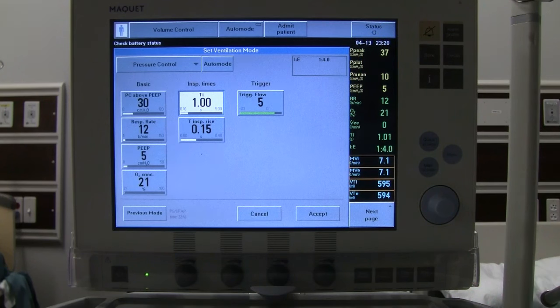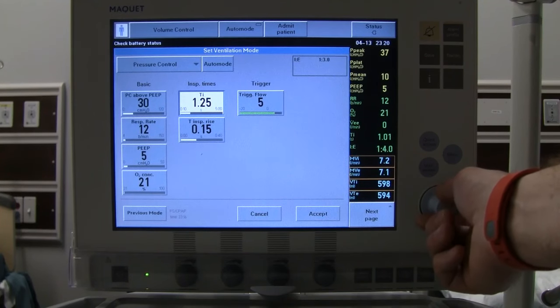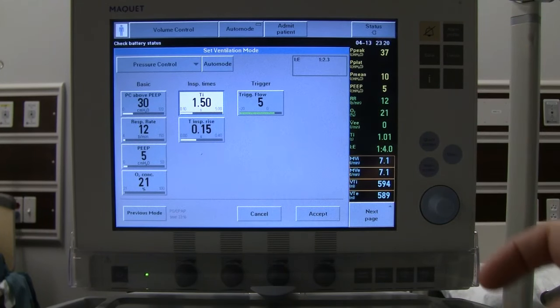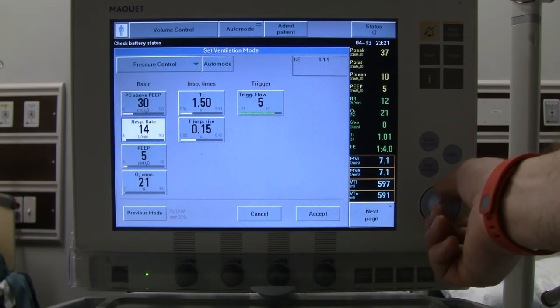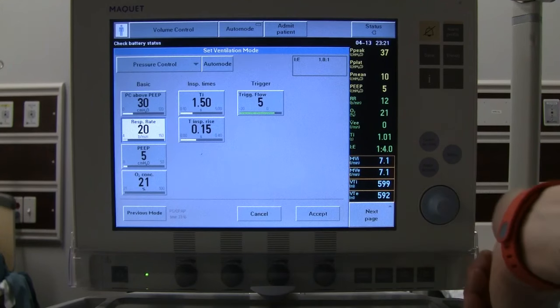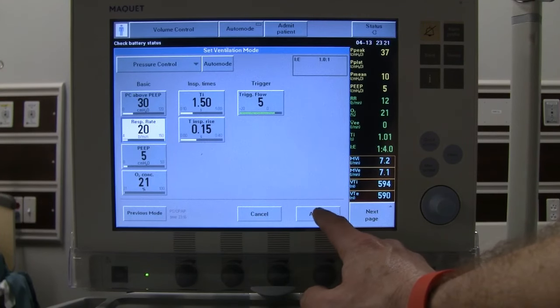To tighten the I-to-E ratio, increase the I-time — we'll stop at 1.5. Because smaller volumes result from worsened lung mechanics, we also need to increase the rate to compensate for minute ventilation. Dialing the rate up to 18 gives a 1-to-1.2 ratio; going to 20 gives a 1-to-1 ratio. We'll set it at 20 and accept. You can clearly see the difference in how the machine ventilates with a 1-to-1 ratio.